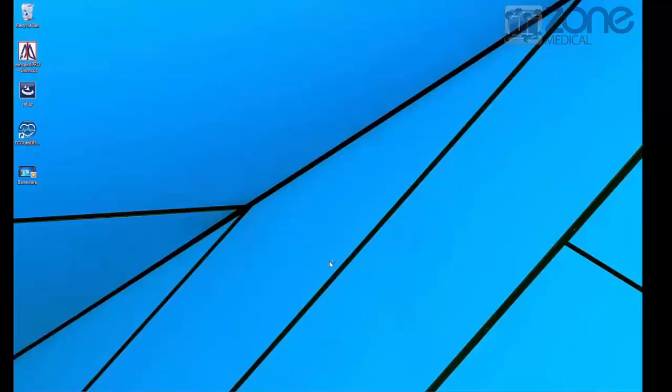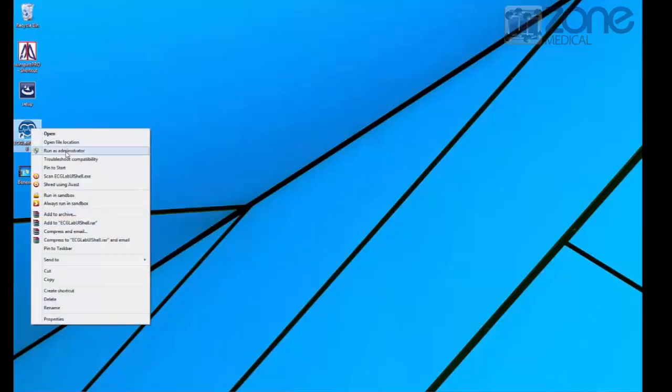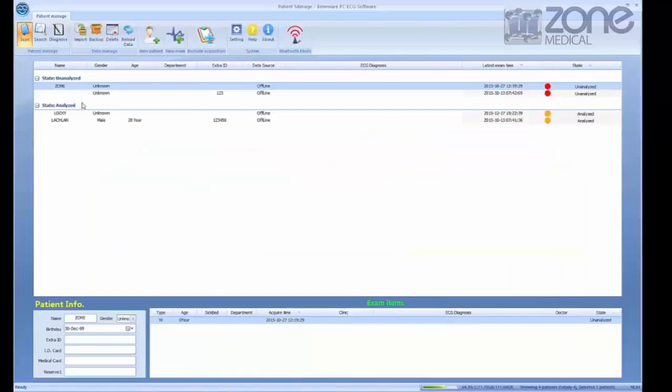First, you'll need to open the software and run as administrator. After this, you can either choose to add a new patient or run a scan from an existing patient.